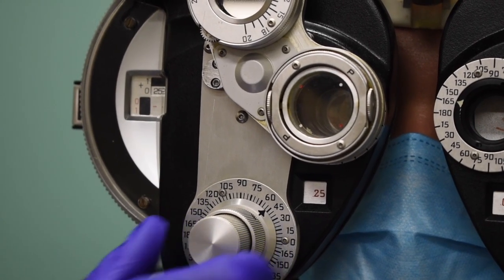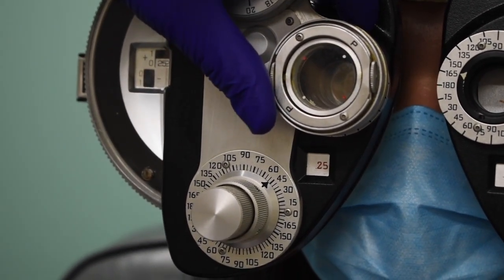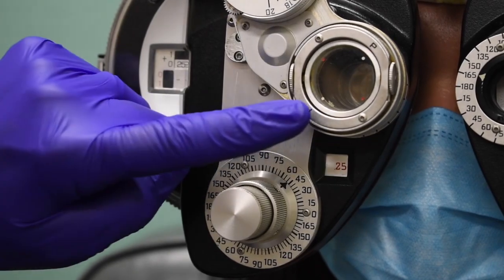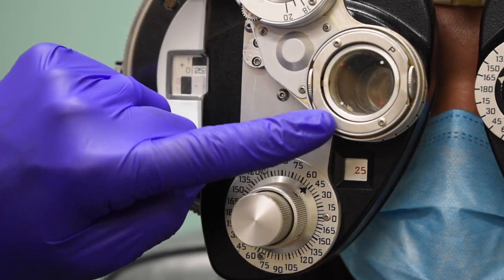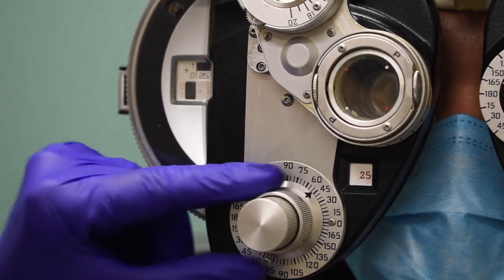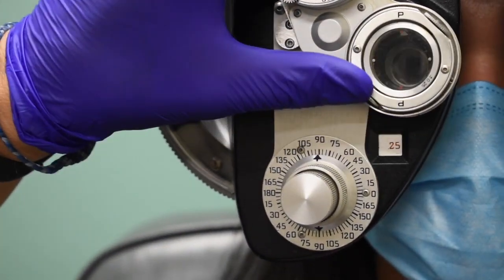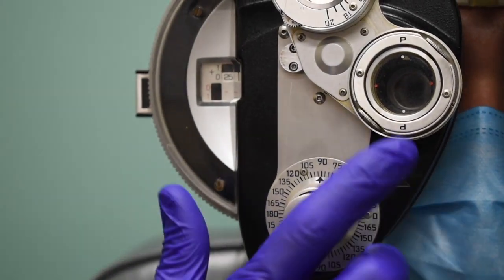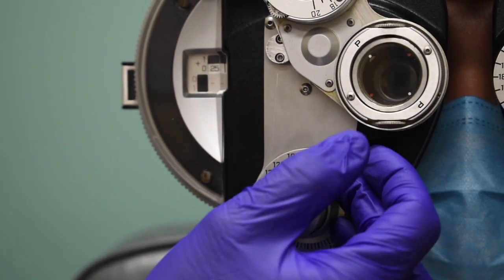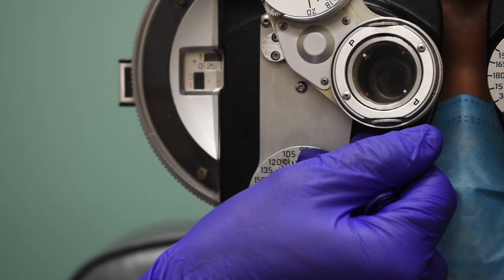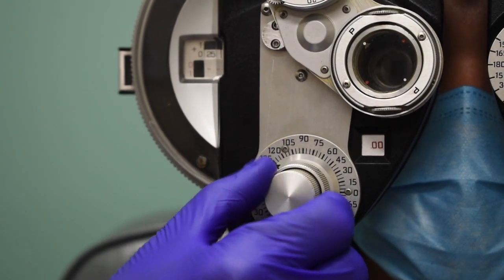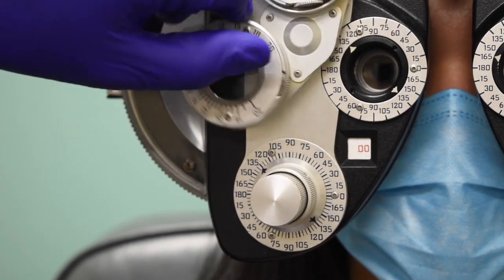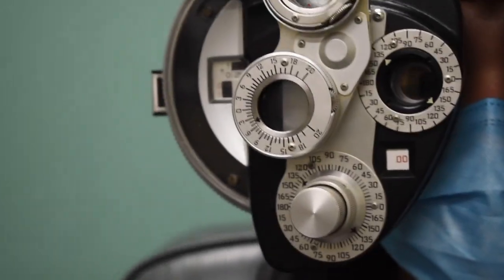So I'll begin my power search, moving it to axis 45. How about one here or two? Two. Good. Again, we know that she doesn't want it here because the white dots are in alignment with the axis indicator arrows. We'll move it to 90 now. Is it more clear with one or two? Two. Good. She doesn't want it here either. And then we'll come over here and is it better with one or two? Two. Excellent. So here Phoebe has told us that she doesn't want any cylinder power at any of the principal meridians. Therefore, we've completed the cylinder power search for her right eye.